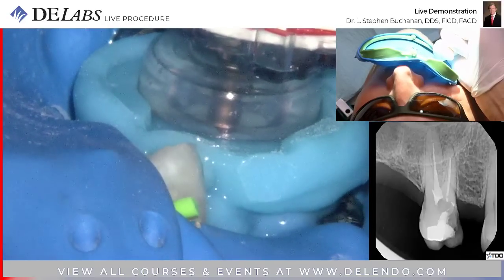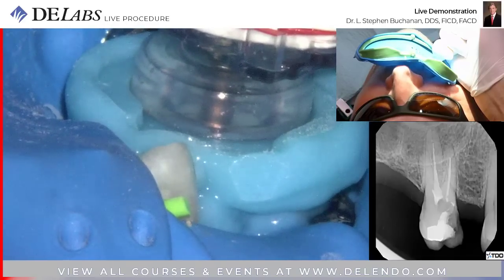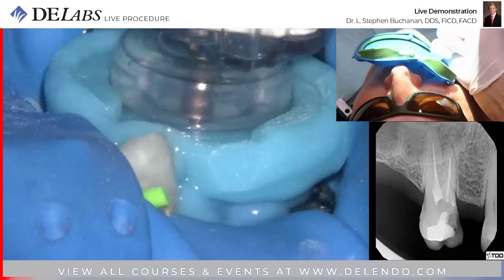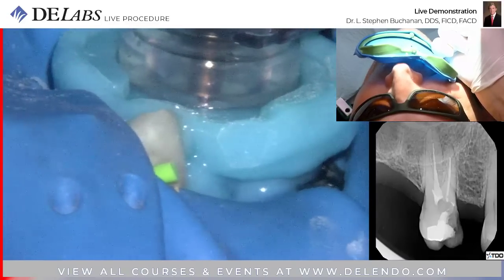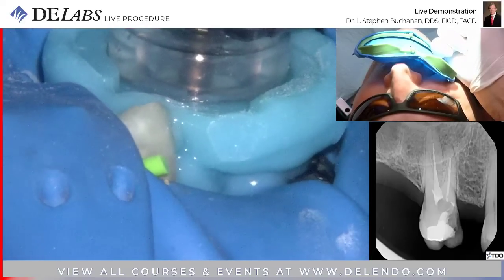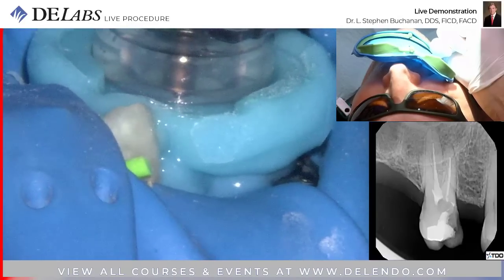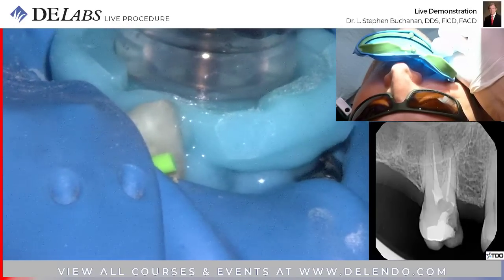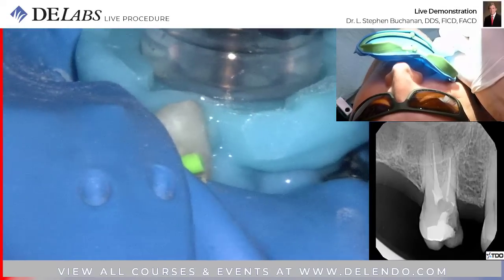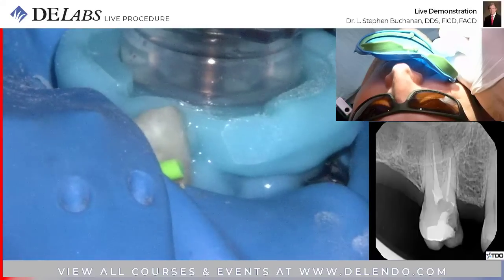Okay, almost 4 minutes. This is where I'm going to be using negative pressure irrigation. I'm going to be probably using an Irisafe. It's like a 25K file without any edges on it. That's an action device. I'm going to activate the solutions with that. Yeah. We'll talk about that back in the lab.